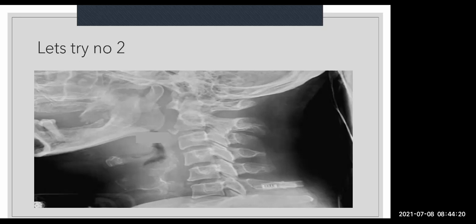So if you had to describe this now to Dr. Kubeka at 3 in the morning, you would say, I've got an avulsion fracture of C2. I'm arranging the CT spine for you, CT C-spine, and I will let you know what's going on. Ideally they should come and do it, but we know how our doctors are.